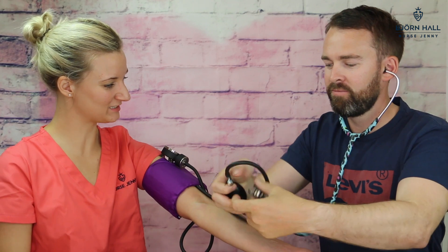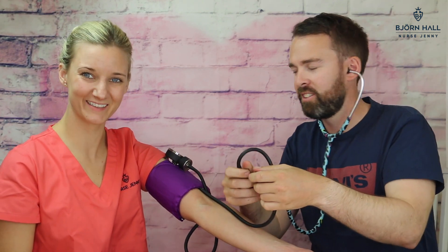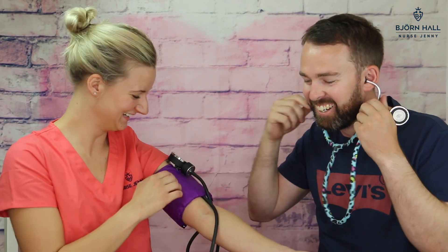120 over 70. I have a heart! That's great. She has a heart. Don't forget to release the pressure. There you go — my arm's falling off. Well done. So now if my husband, who is a non-medical person, can learn from that little video on how to take a blood pressure, so can you. See you guys.